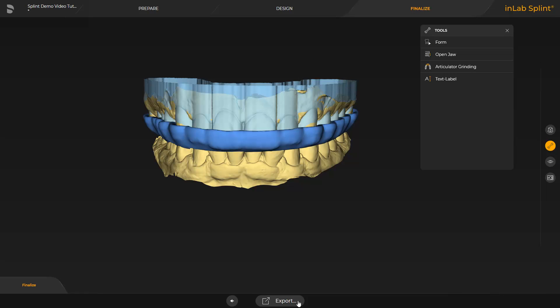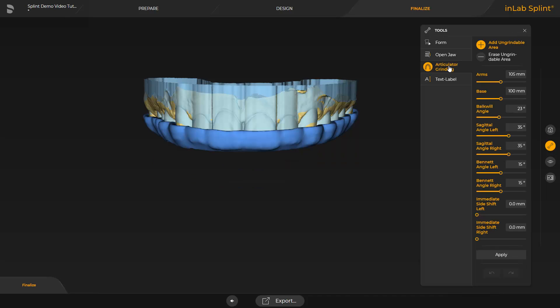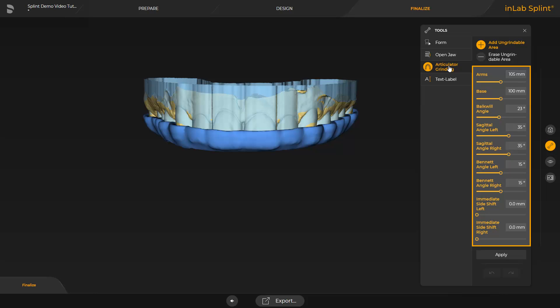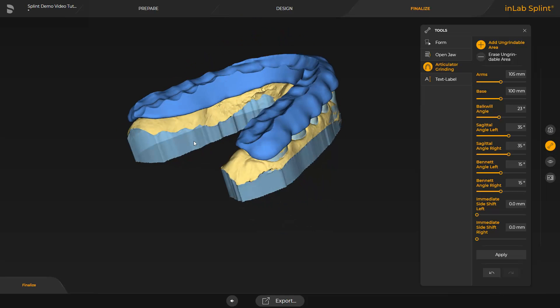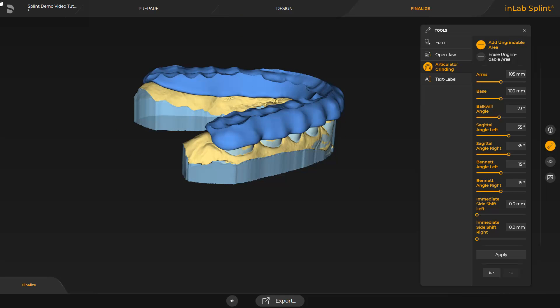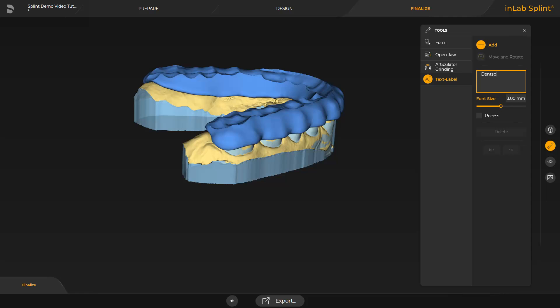Here there are also several options available. We will focus on the Articulator Grinding and Text Label tool. A list of articulation values which can be used opens up. We select the medium articulation and confirm with Apply. Finally, we put some text on the splint so that this can be matched to a patient, for example. With the click of the left mouse button, the text is placed.